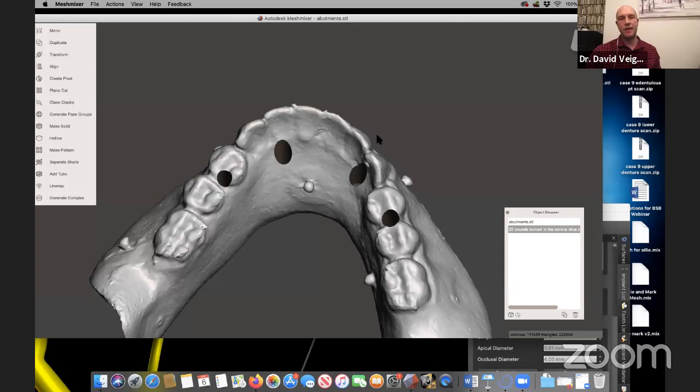That makes sense. So let's say, for instance, I've got 6 implants I'm going to place. I put the guide on, I drill my first sites, all of them. I go back and place that drill back into a couple of the sites. And then I go back and drill the rest of them, just to help position. Where the guides become most unstable is in the lower arch. You have a very minimal amount of ridge in the lower arch. Well, anything down there, the denture was sloppy, the surgical guide's going to be sloppy as well.